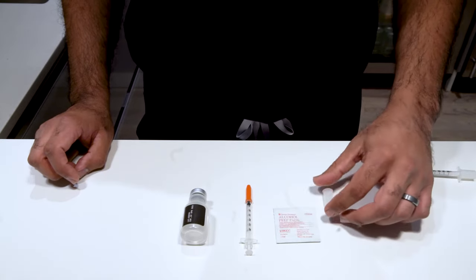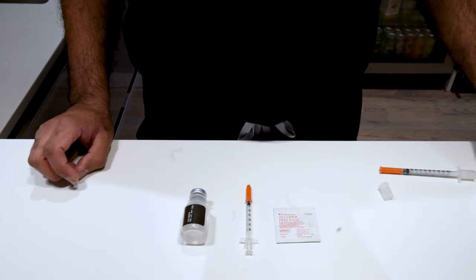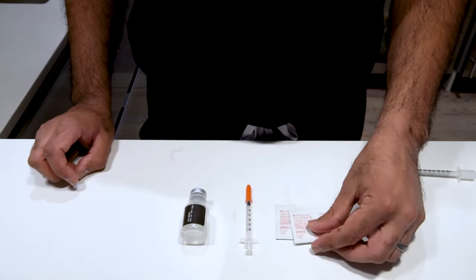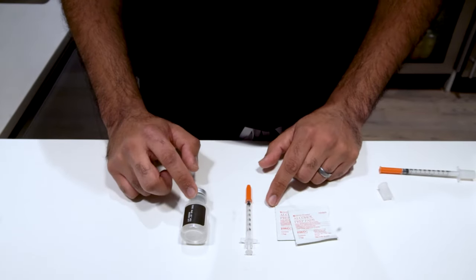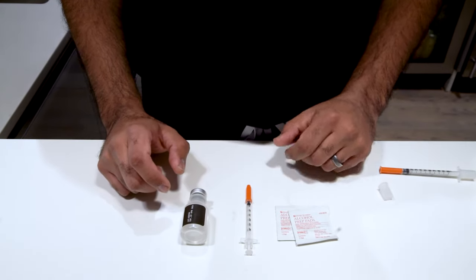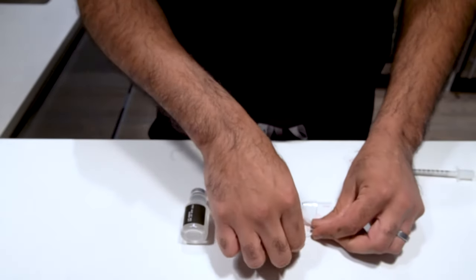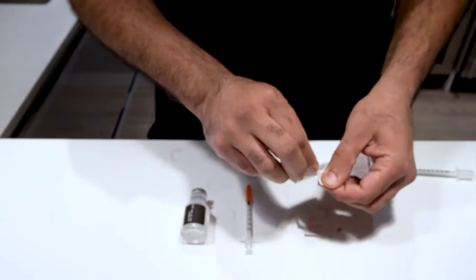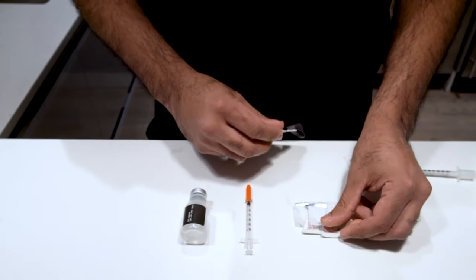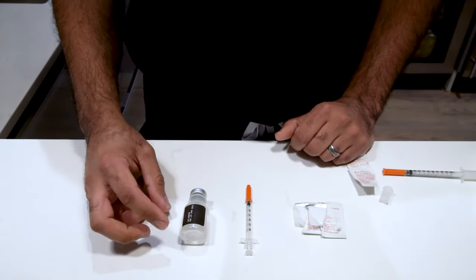Second, you're going to get some alcohol pads. You can get one or two alcohol pads depending on how you like your injections. We use one to clean the bottle and one to clean our skin. When you get your alcohol pads, go ahead and open these up, get them ready such that they're easy to reach out to, just like this.